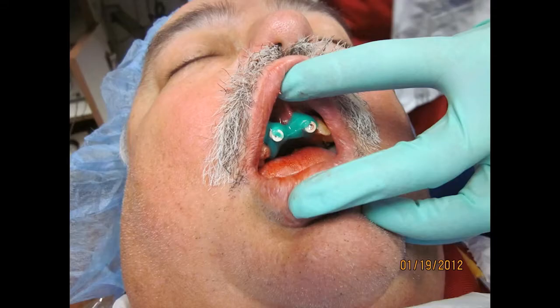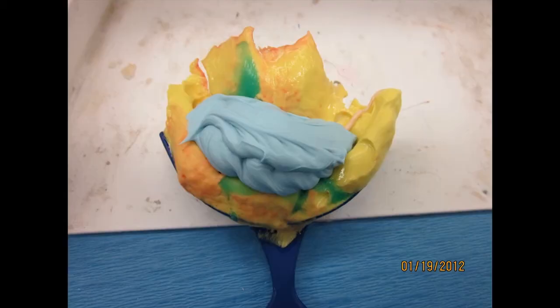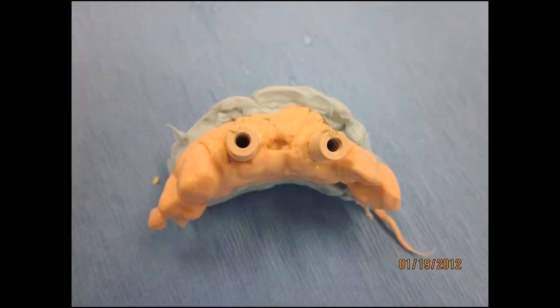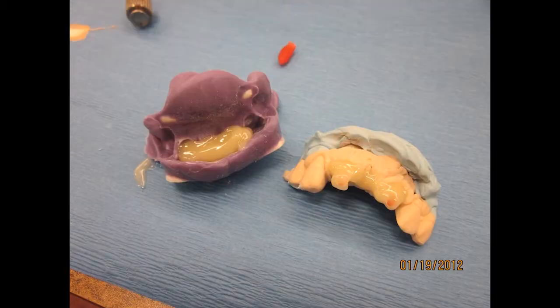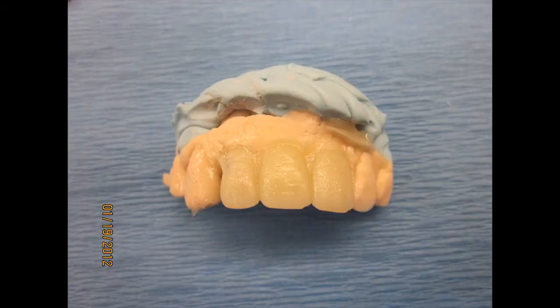We pour this up with Mach 2 and Blue Moose from Parkell to get a rubber model, then do all the work outside of the mouth instead of in it. I use a diamond bur to prep the abutments back on the model, use a lathe, block out the screw holes, and take my preoperative impression with Integrity or XactoTemp, then seat it over. Now I can make my temporaries — I've customized the PEEK abutments and fabricated the temporaries entirely outside of the mouth.